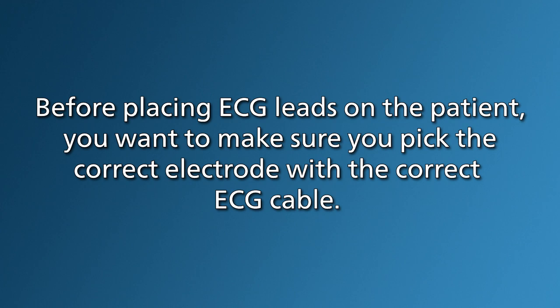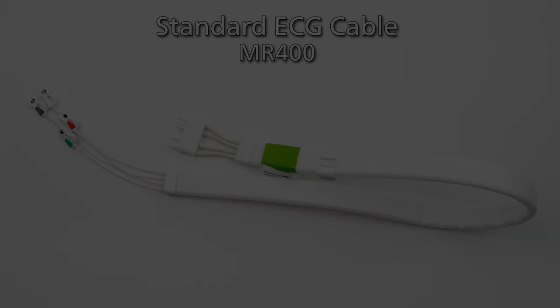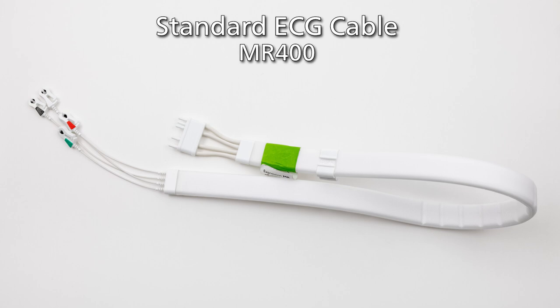Before placing ECG leads on the patient, you want to make sure you pick the correct electrode with the correct ECG cable. For the MR400, there are three types of ECG cables that pair with the three different electrodes. The standard ECG cable is designed for patients weighing more than 22 pounds or 10 kilograms and is made for quick application with the use of the single patch or standard electrode.